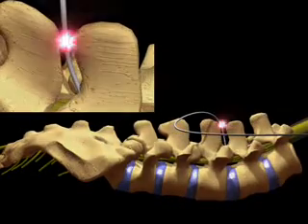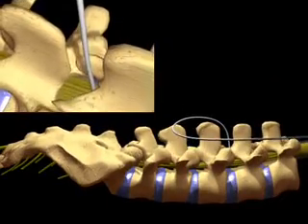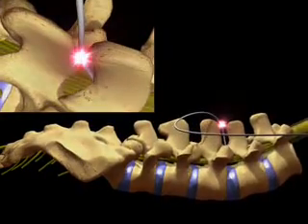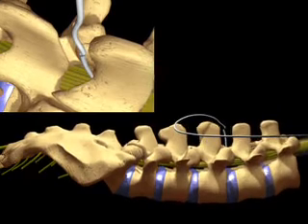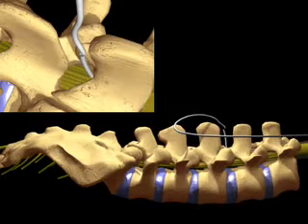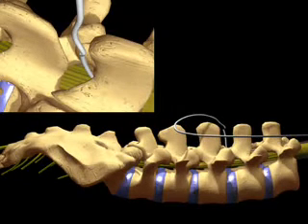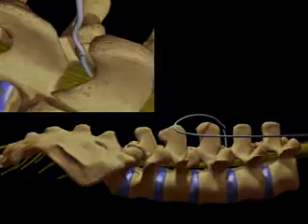Over time, the spinous processes and ligaments may compress or abrade the catheter due to friction or pressure. This creates another potential cause for catheter fractures and breaks at the level of the lumbodorsal fascia.